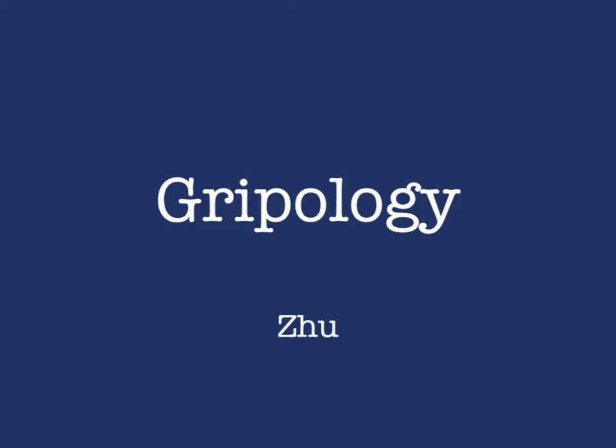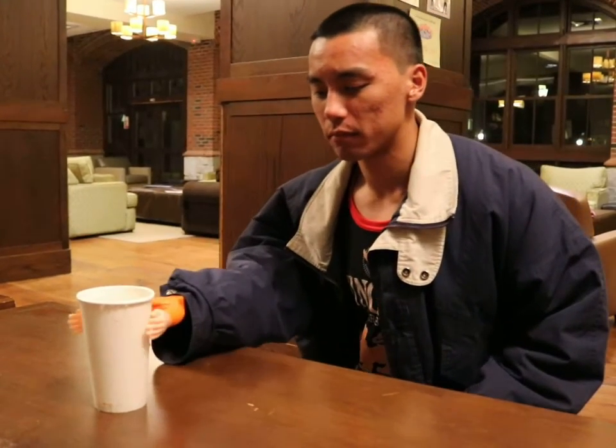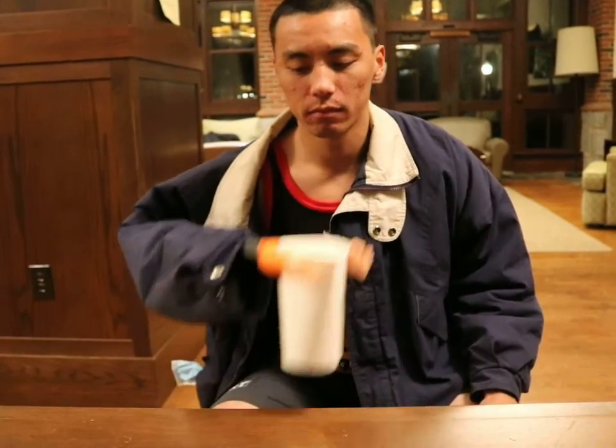Gripology is a teaching tool used by young adults in order to teach them how to whole hand grasp cylindrical items with their hand prosthesis. You have many types of cylindrical items that can be found around the house that have different sizes, different shapes, different weights, and all these attributes play into how well people with hand prosthesis grip the items. Without a sense of touch, sometimes you grip the items too much and crush the items, or sometimes you grip the items too loosely, resulting in you dropping the item.